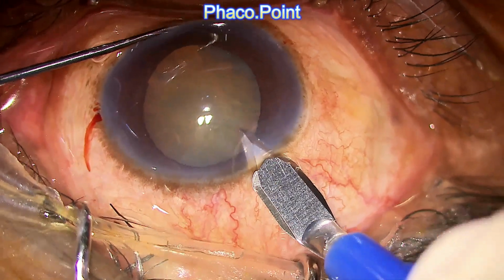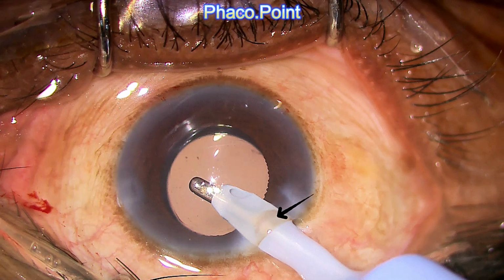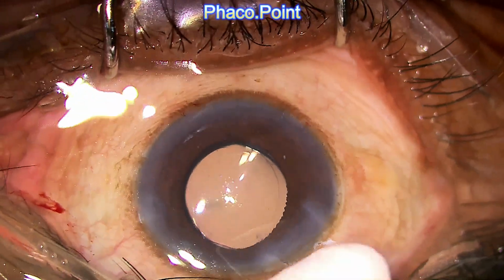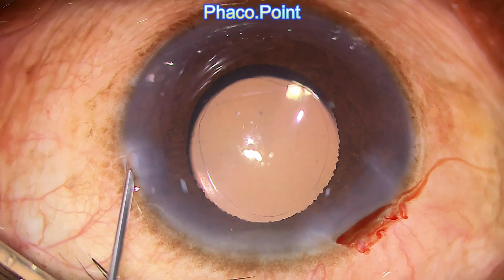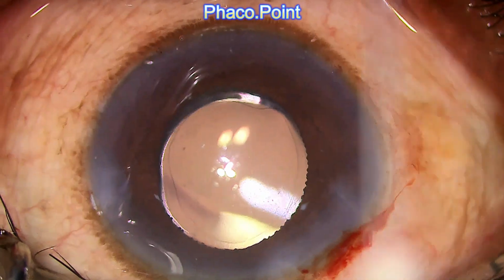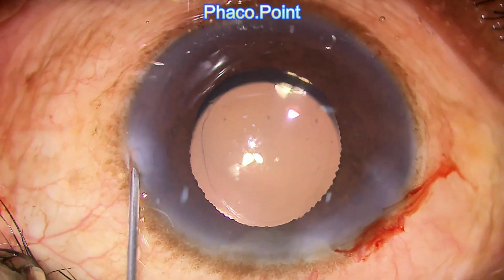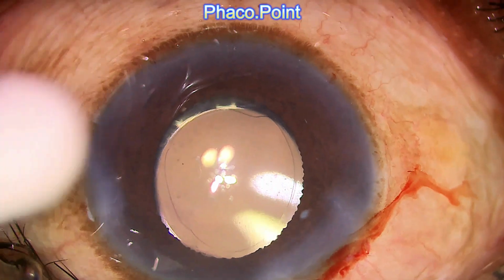And let's take a final example in this case. I've come to the end of the surgery, and the incision, you see that the upper lip is actually turned inwards. So there's uneven thickness of the clear corneal incision. Let's see if this incision will seal if I inject BSS to the side port. And as I inject, you can see that there is definitely stromal hydration occurring at the clear corneal incision. Patient moves slightly, and therefore I lost my grip. So injecting further, you can definitely see there's a stromal hydration, and the eye has actually become rock solid and rock hard.